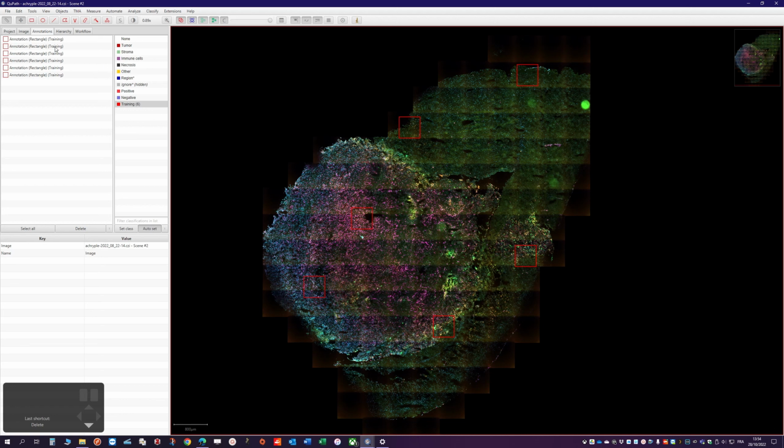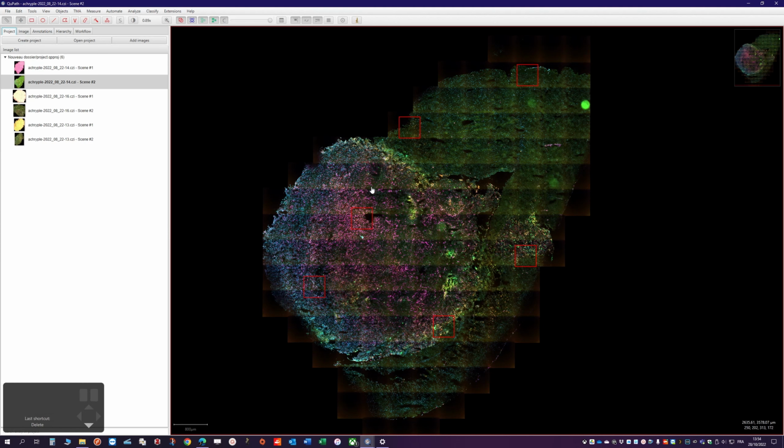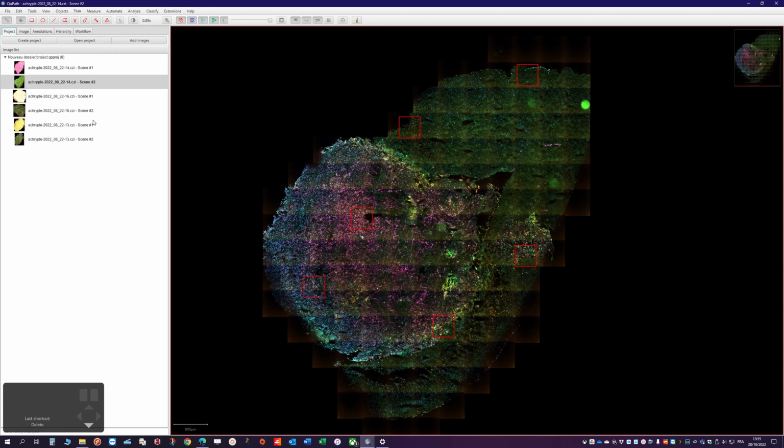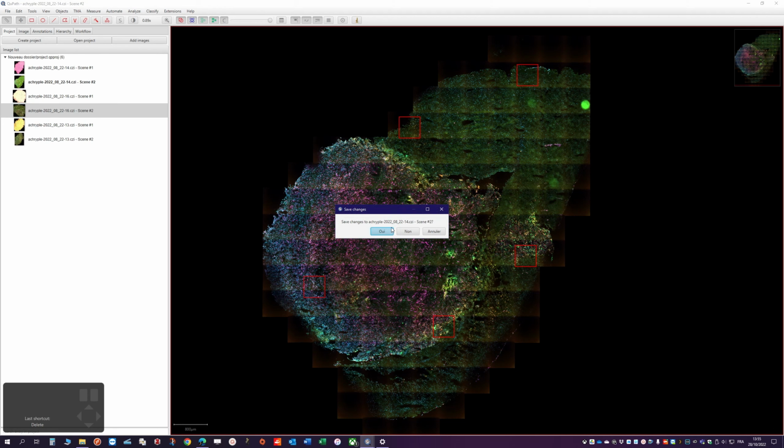The problem is, if you want to be really thorough, what you need to do is use another image, or maybe several of them, just to be really complete and not be biased towards the sample itself. So let's just change the image right now and keep the same procedure. I want to save the changes, yes.